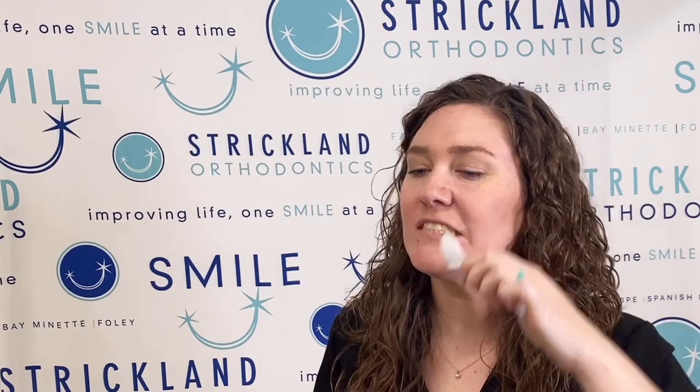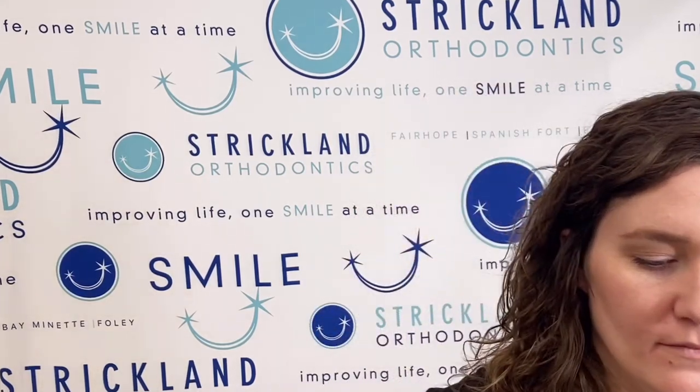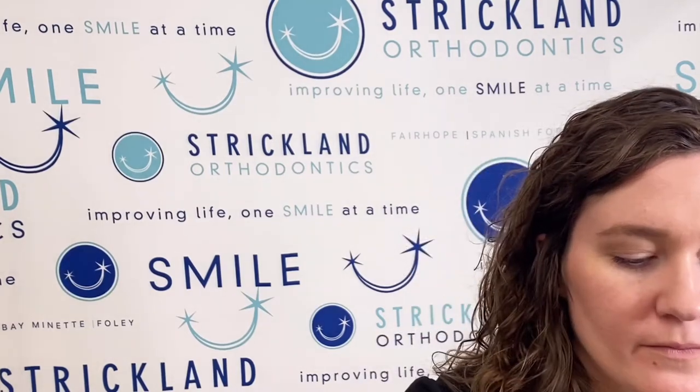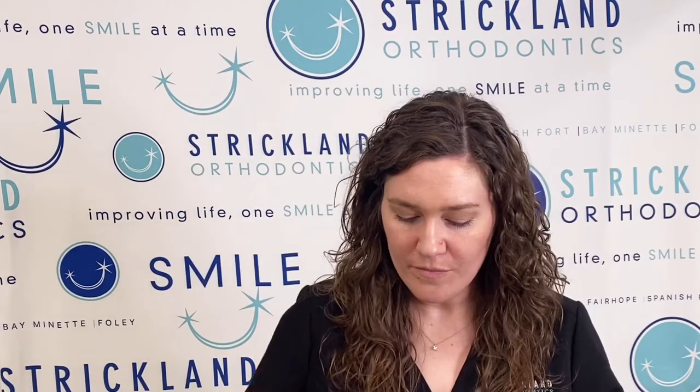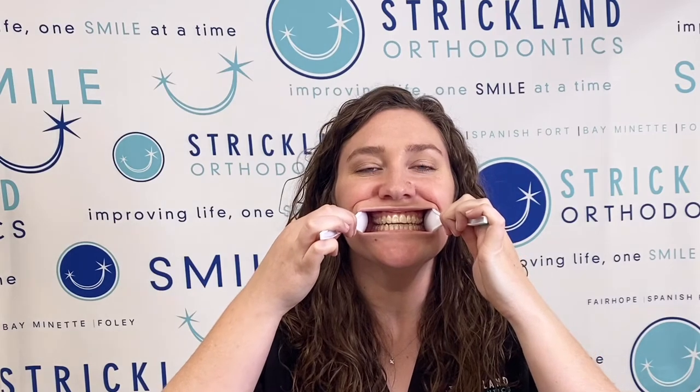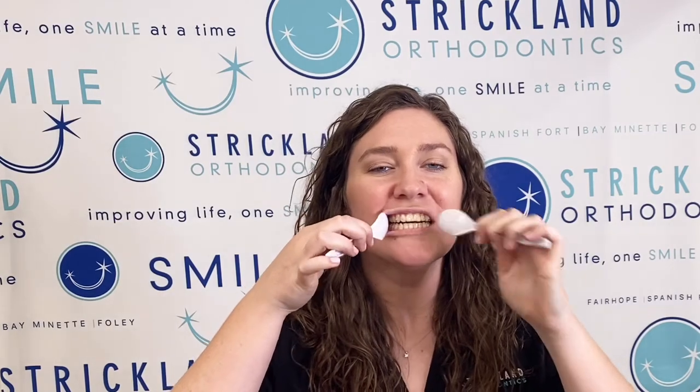You'll want to repeat those pictures with the aligners in. The difference with the pictures with the aligners in is you'll want to make sure you seat them all the way, but then don't bite down all the way. For the front picture, just have a little bit of air gap between the upper and lower front teeth. Then you'll do the same thing for each side picture.